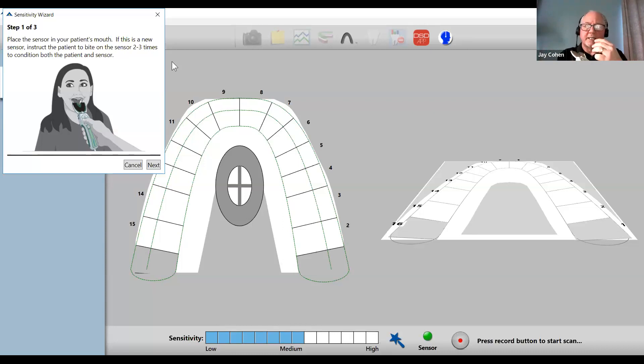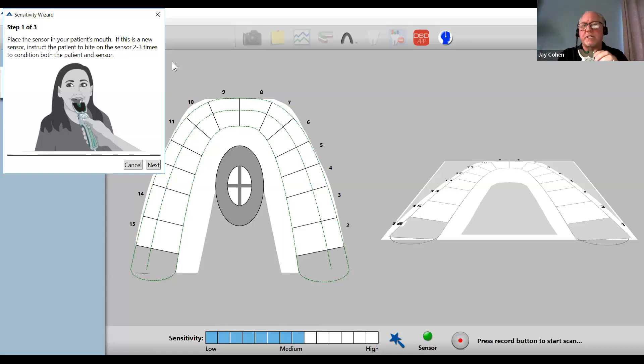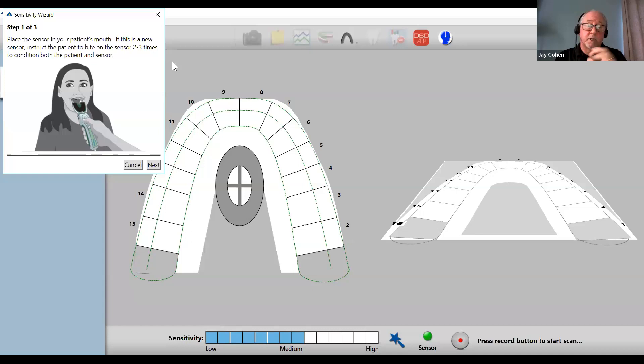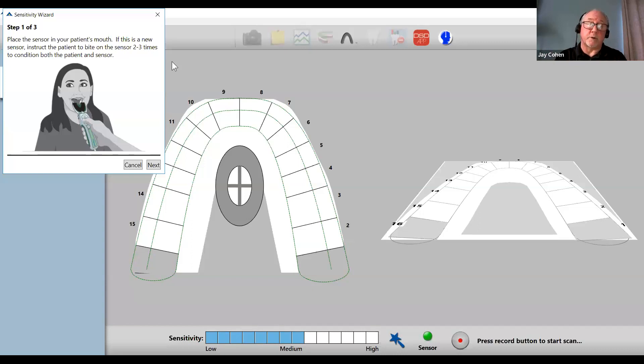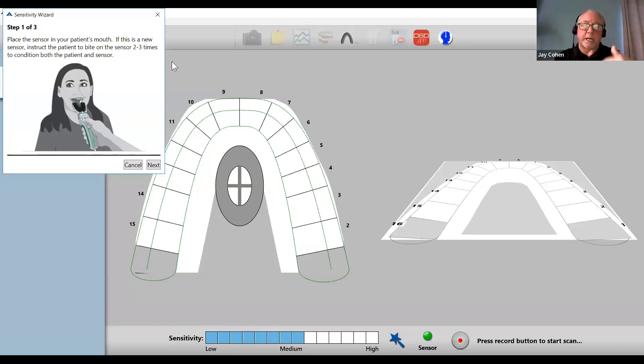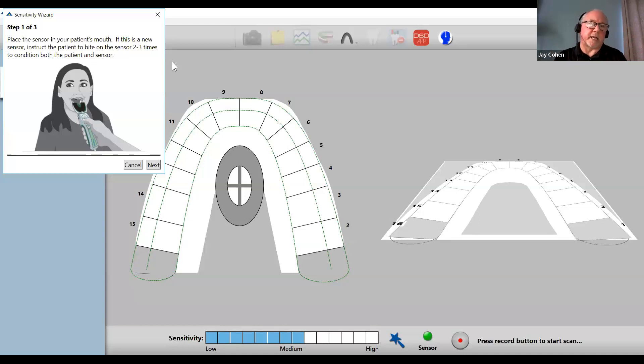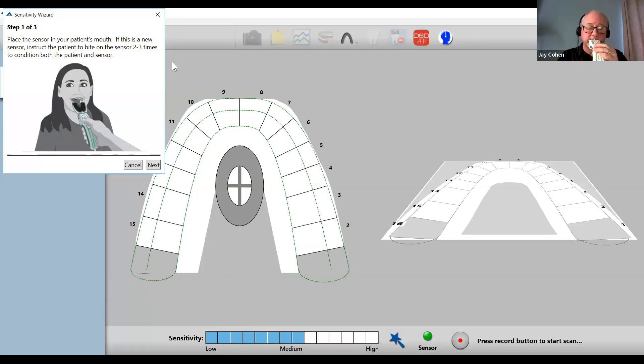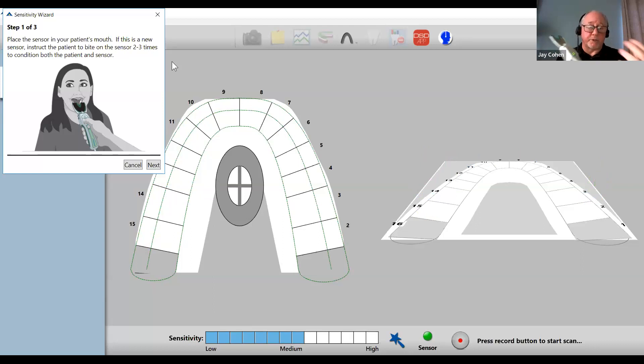This is the opportunity to have the patient practice their bite, get acclimated to the sensor, get comfortable biting. The T-scan sensor is not a natural thing to bite on, so it takes a few bites. Oftentimes you'll see the very first bite, light contact on the anterior teeth. Ask them to bite on their back teeth, and you'll see a completely different profile. We want to create a profile where you're seeing all of the teeth touching around the entire arch, even and repeatable. When you start to see a reproducible bite, that's what we're aiming for.